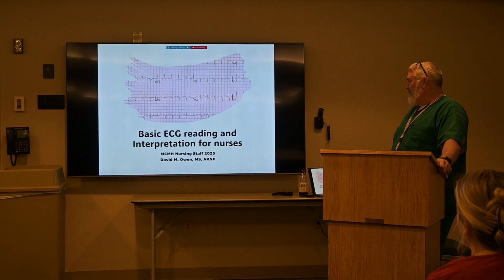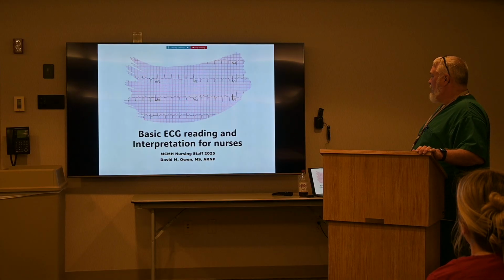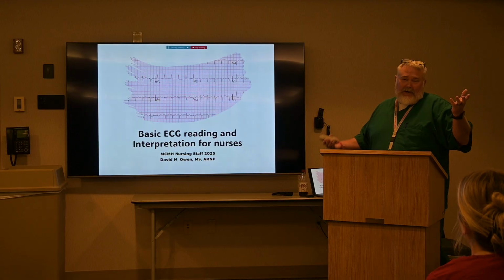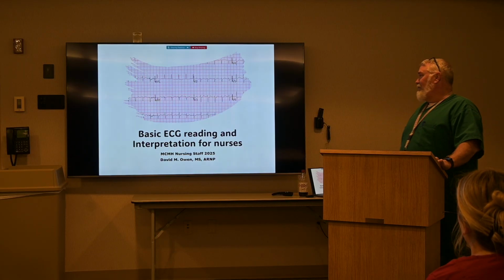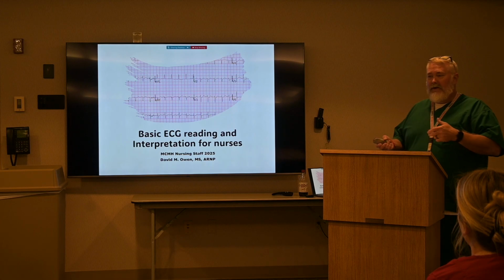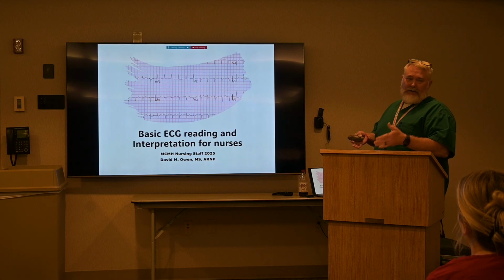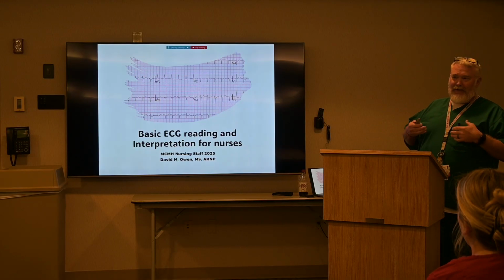I'm one of the hospitalists here at MCMH. A few months ago, they asked me to put together just a basic ECG reading and interpretation class for nurses, for staff, or anybody that wants to come and check it out. So I put together a little class. A lot of this will be review, but some of the concepts in regards to how to read an ECG rhythm strip and different ways to do it, you may or may not have been taught over the years.